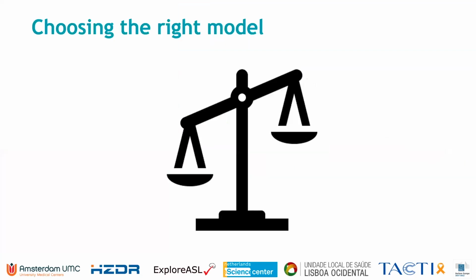So choosing the right model is quite a balance in itself. There are a lot of available models that have been pre-trained and validated now as well. But I would say one of the main considerations in itself is also what you have available yourself. So what kind of sample, what would it be that you would be interested in, as well as, for example, also your computational resources or the amount of data.